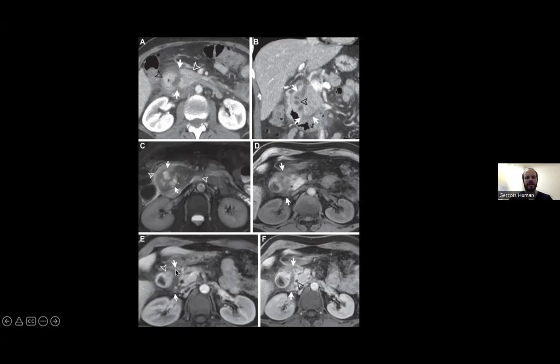Here we can see nicely that the pancreatic head is medial with the CBD looking quite normal, and then a thickened medial wall of the duodenum. On later imaging, this actually started enhancing owing to what they would say is increased fibrosis in this region, and this is a presentation of paraduodenal pancreatitis.